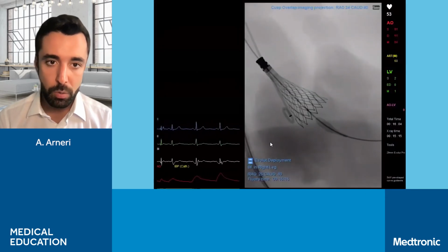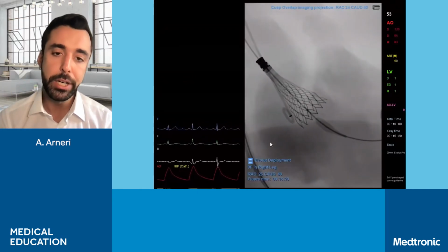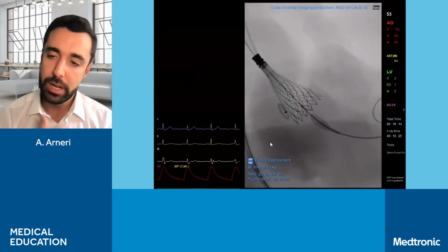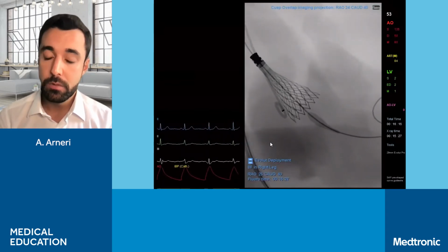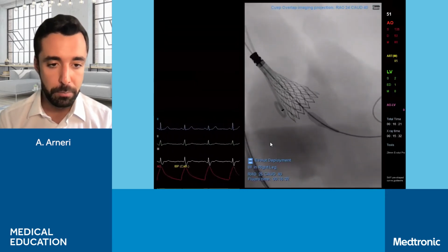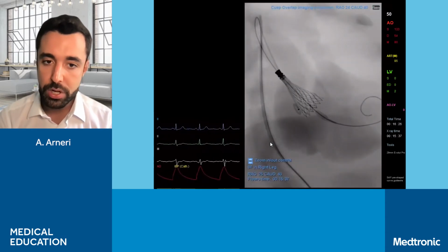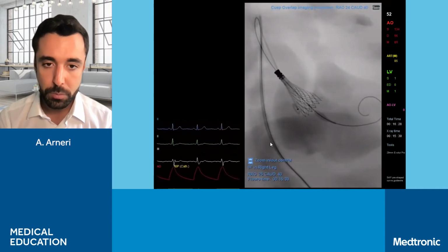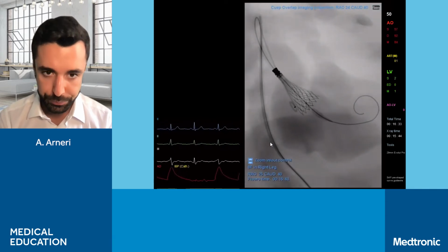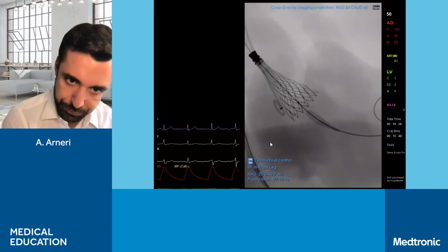Okay, you see now we have reached with our radiopaque marker the other pedal attachment marker. So we are 80% release. The valve now is not released yet, so you can still recapture it, but it's working. So it's no problem for the patient. Is not blocking the blood flow. And now we can check if we like the position and if we want to release our valve. So as I mentioned before, we want 3 millimeter implant depth. So we can zoom a bit to see if we are really at 3 millimeter.